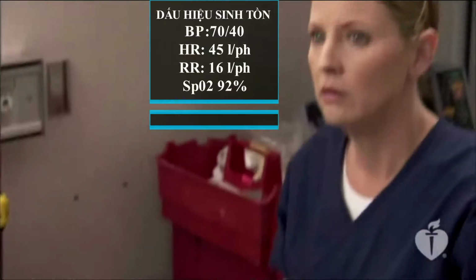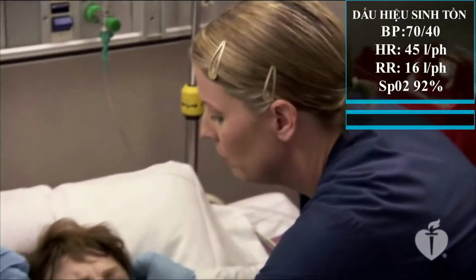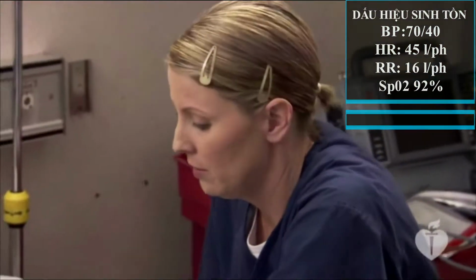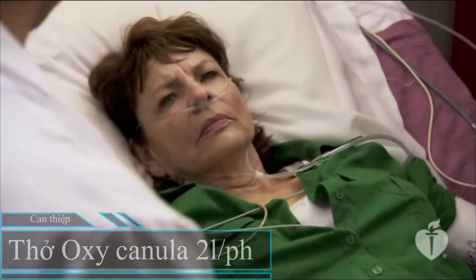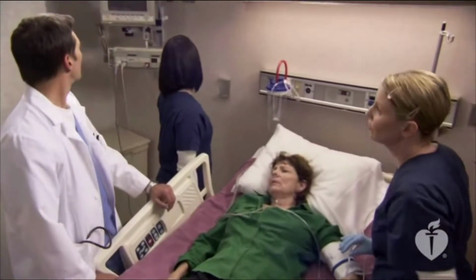Joette, do we have a set of vitals for Ms. Fernandez? Yeah, blood pressure is 70/40, heart rate is 45 beats per minute, respiratory rate is 16 breaths per minute, and pulse ox is 92%. Okay, let's go ahead and start her on 2 liters of O2. Ms. Fernandez, we've got you hooked up to a monitor so we can take a look at your heart rhythm, okay? And we've started you on oxygen so you can breathe a little easier. Your pulse ox reading is 95% with 2 liters of O2.